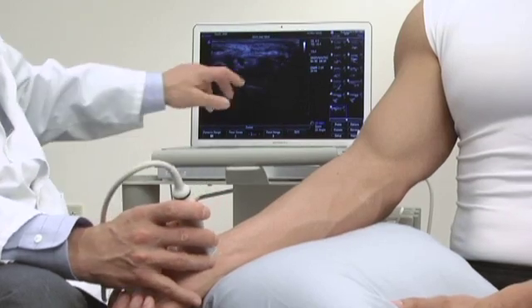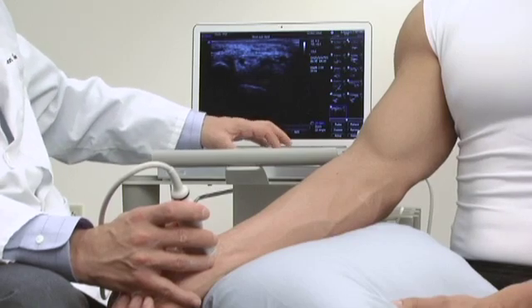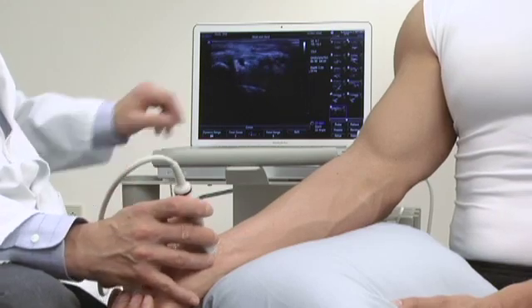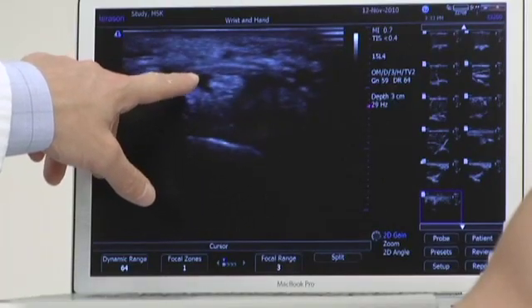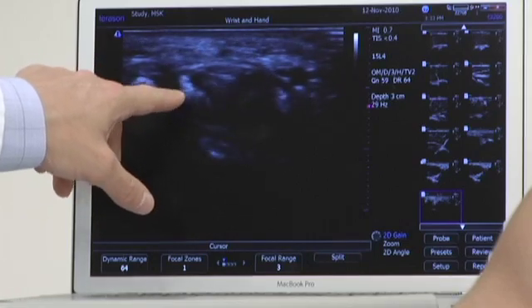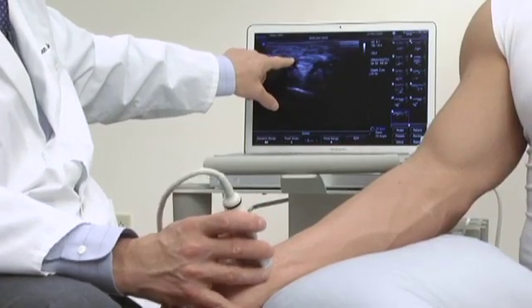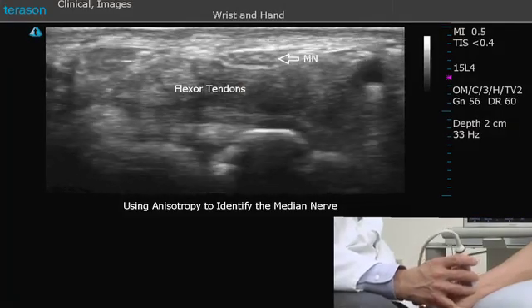By tilting and toggling the probe, we'll see that the tendons — and I'm going to increase the gain a little bit and drop the focal zone down into that region — become bright and dark as we tilt the probe, whereas the nerve remains relatively the same. Although the nerve is also somewhat anisotropic, it is not nearly as anisotropic as the tendons, meaning that when I tilt the probe, the tendons will flash bright and dark whereas the nerve will stay relatively the same. That's one trick to help you in identifying the median nerve.